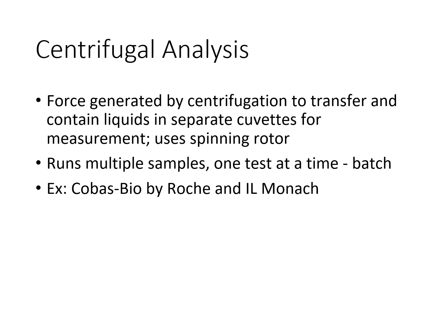Some advantages: it does have precise containment of samples and reagents, which minimizes cross-contamination. Efficient handling of multiple samples with good reproducibility. Now, some limitations: it is limited to running, like we mentioned, one test per sample at a time, which may affect throughput for high volume labs. Batch processing means you can't usually add a stat sample easily without interrupting the batch, which could obviously cause trouble if you think about it, right?